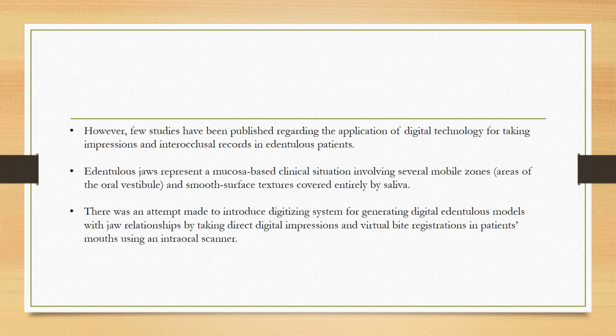Okay. However, few studies have been published regarding the application of digital technology in records of an edentulous patient. So studies are still going on. The edentulous jaw actually represents a mucosa-based clinical situation which involves several mobile zones, that is the oral vestibule, and a smooth surface texture which is covered by saliva. So there are still attempts made to introduce the digitizing system for generating a digital edentulous model.